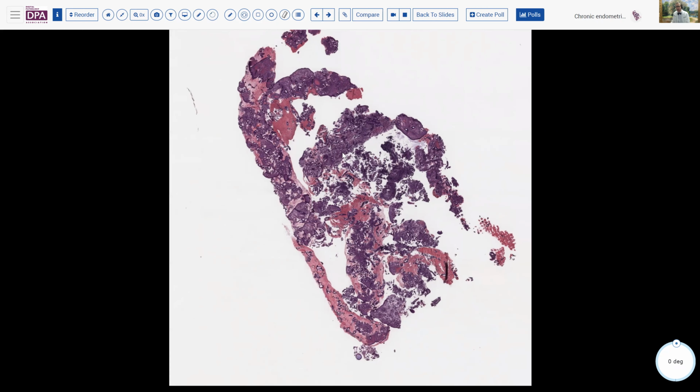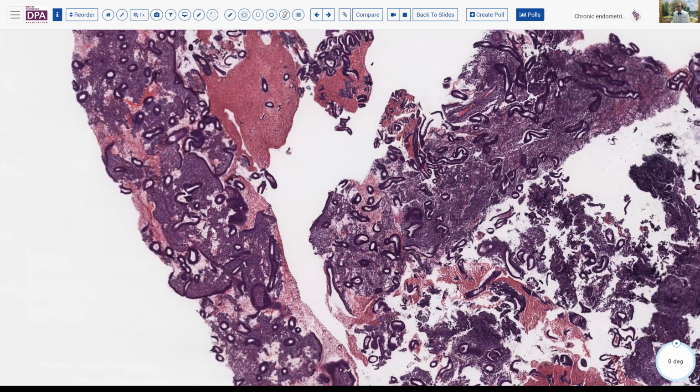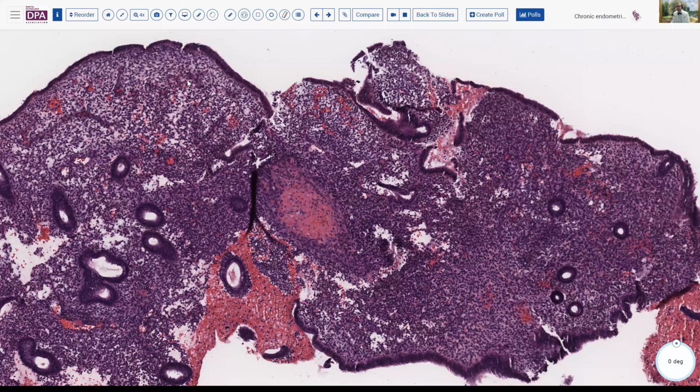Well, here's another case, maybe a little bit more atrophic appearing or inactive appearing tissue. And this illustrates another challenge. So here we again see these little hemorrhages and microthrombi here, sort of features here. We don't have the same degree of surface breakdown change that we might associate with this change.